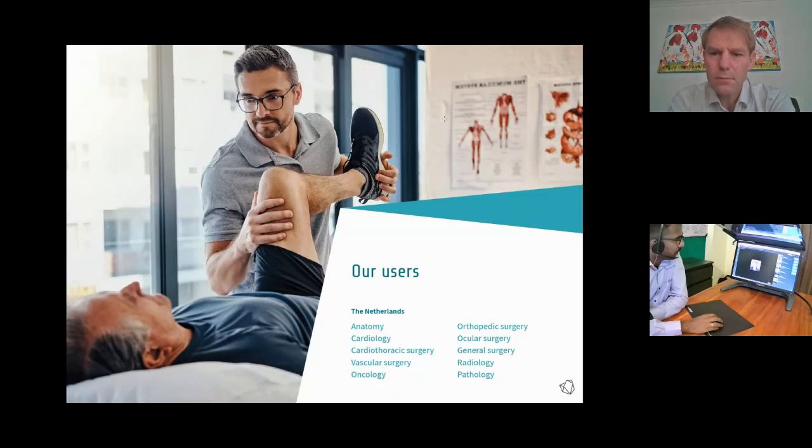But to treat it, you need the whole structural information. You need the whole patient because you have to approach this area. And the moment you only have the problem as such but you don't know how to get there, you still have a problem. That's especially where applications such as Visualisation 3D come in really valuable.